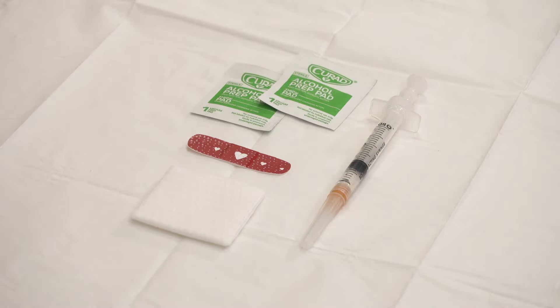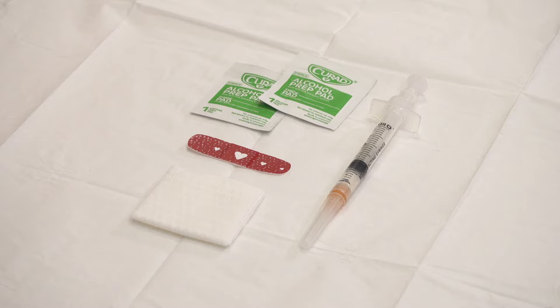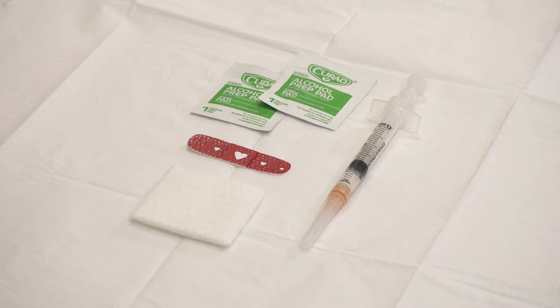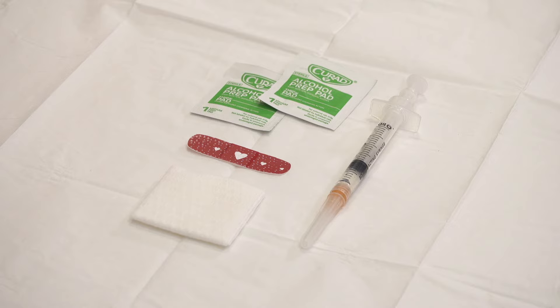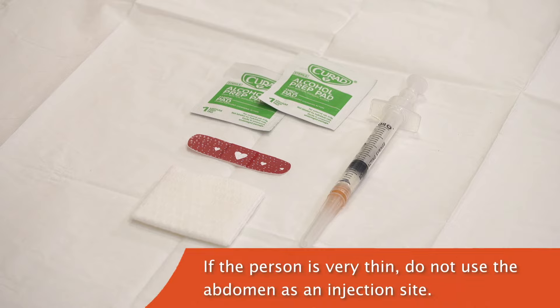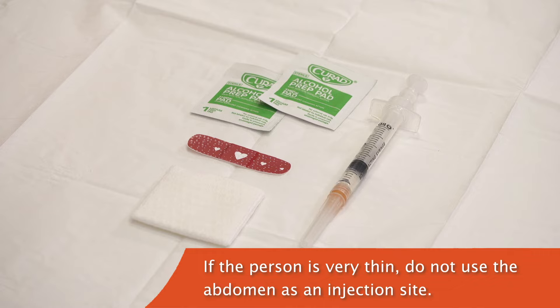Prepare your supplies and any other materials needed according to the package instructions. This includes selecting a needle and syringe of the appropriate length based on the person's build and physical characteristics of the injection site area, such as weight and subcutaneous fat distribution. Also remember that if the person is very thin, do not use the abdomen as an injection site.